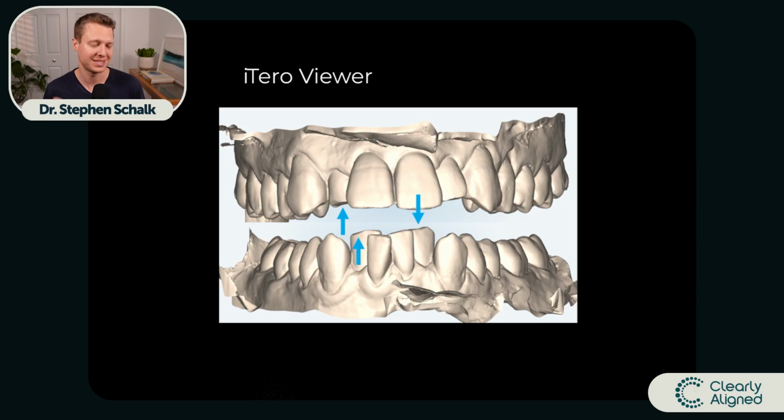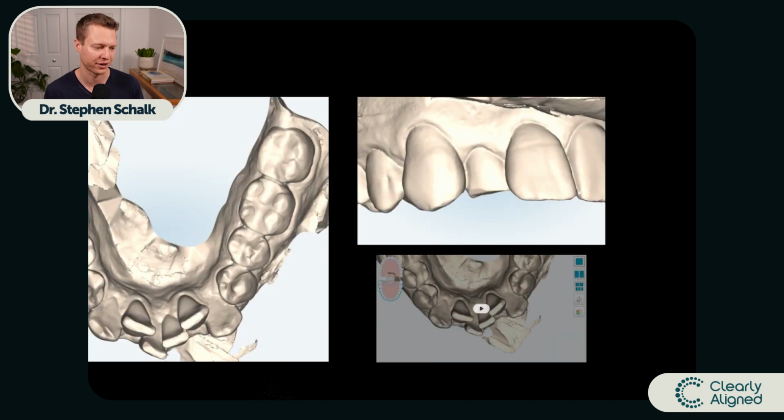If you have a patient who doesn't understand the orthodontic benefits, it's going to be by visually looking at their teeth and going down a path of self-discovery. My recommendation then is take a scan on every single patient, and you can evaluate it with them to show them the chipping and wear and damage that's occurring on their teeth. Now, I like to always use the stone view in the iTero viewer. And the reason why is because it really just shows the detail better.